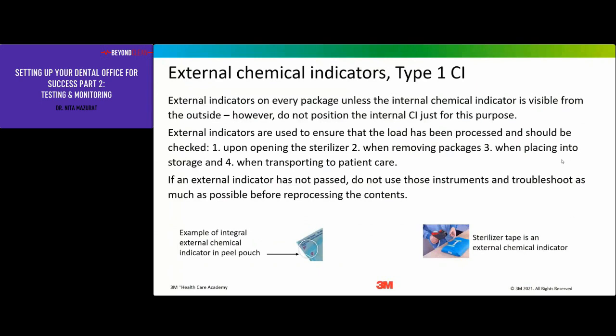They didn't check the parameters. When they opened the sterilizer, they didn't check the external chemical indicators. To me, the packages feel so different when they're sterile, so I don't understand how that's happened, but it does. Busy people are busy people, and it happens.